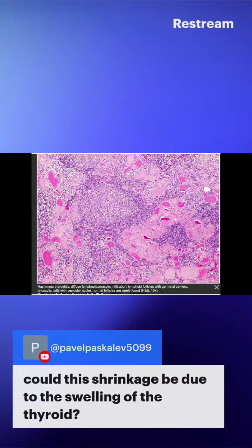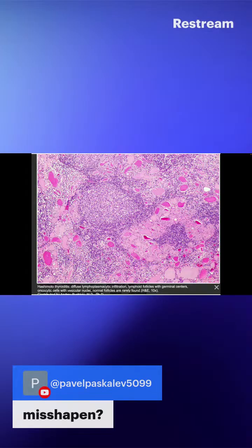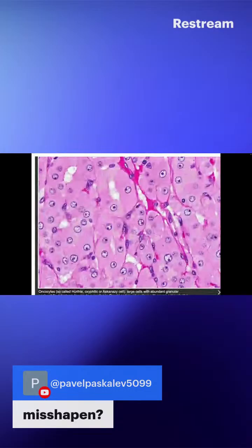You can see here the thyroid follicles, and they're becoming small, and there's not a lot of variation, no a lot of macrofollicles and microfollicles. And you can see the cells themselves look more pinkish. This is a closer look, so they are pinkish.